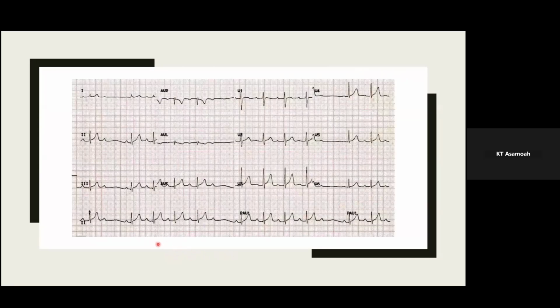Now in this one, when you look at it, first of all, you realize that there's what we call group beating. So you have 4 in a group, and then there's a gap. You have another 4 in a group, and then there's a gap. Once there's group beating, your first suspicion should be a Wenckebach. Then you look at the PR intervals, you realize that here, this is shorter than this, a little shorter, or maybe almost the same as this, and this is longer.